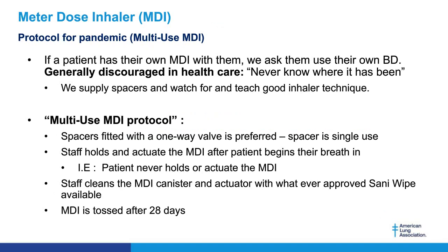This is the metered dose inhaler that I came up with myself, and this is what we're using in the pulmonary function lab at the University of Minnesota. This has always been a no-no, I've been told by my pharmacy. If the patient has their own metered dose inhaler with them, we ask them to use it. In the past, it was always frowned on by my pharmacy department because generally this is discouraged in healthcare, as we never know where it's been. That metered dose inhaler could be years old and might be expired. It could have been sitting on the dashboard of their car in hundreds and hundreds of degree weather, or maybe it was frozen. In Minnesota, that's certainly a possibility. I've seen some people pull MDIs out of their pocket. I saw one, a great guy, an old farmer. His hands were always all greased up and dirty all the way down to his fingernails, and so was his MDI.